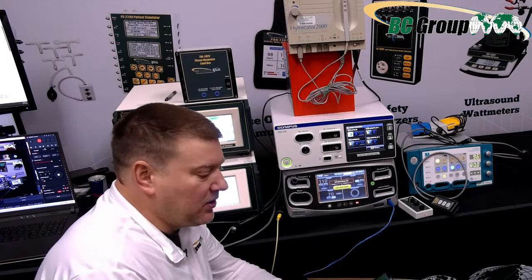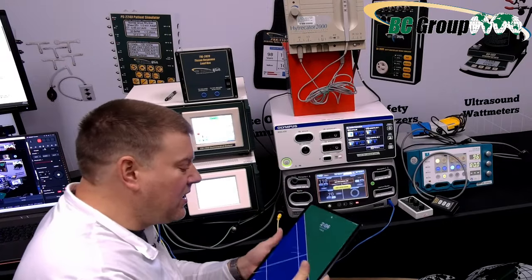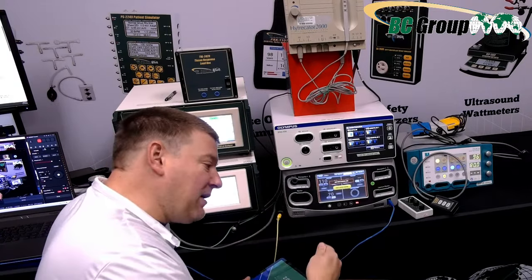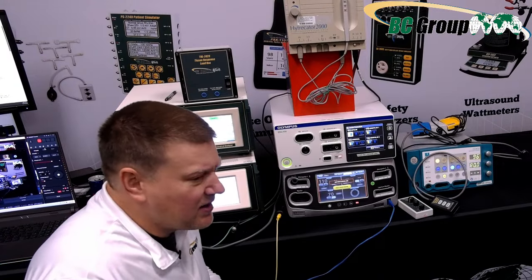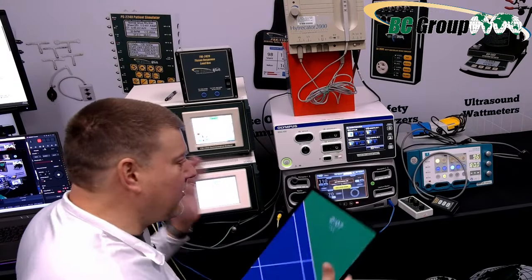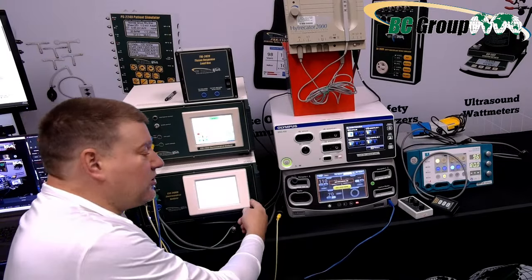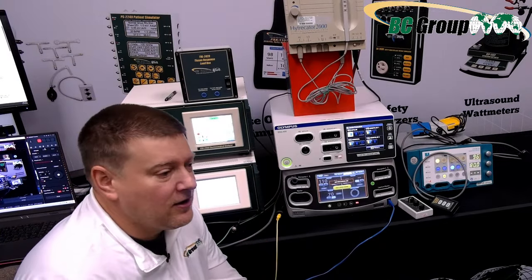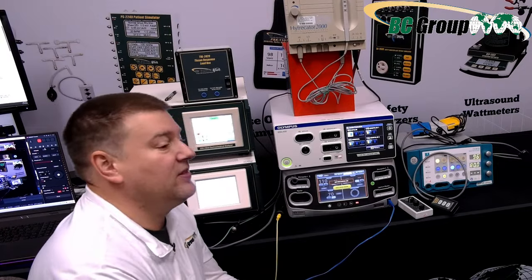And then came the ability to take a photo. So I would have my handwritten notes, which I have pretty good handwriting, and I would snap a photo of my results and attach those to the work orders. And that increased the speed a little bit. Still very unprofessional. Guys, we can do better. So automation, this guy right here, the 2400, 2400H, if you have one and you might be interested in automating that bad boy, let me know.